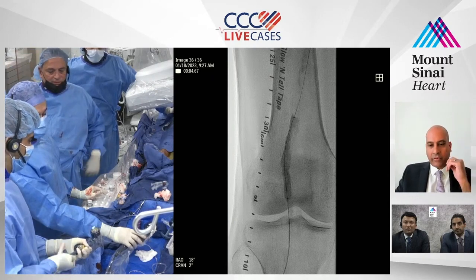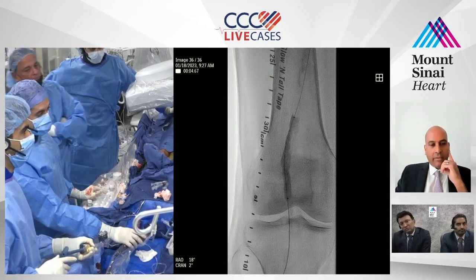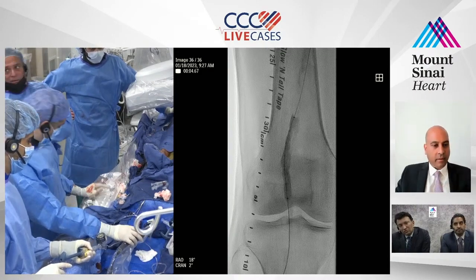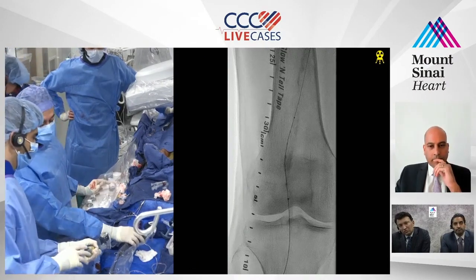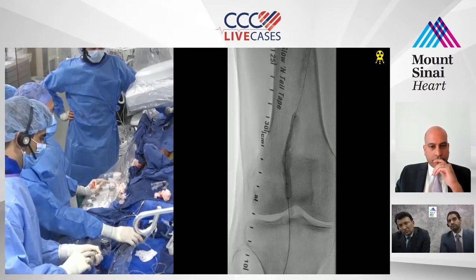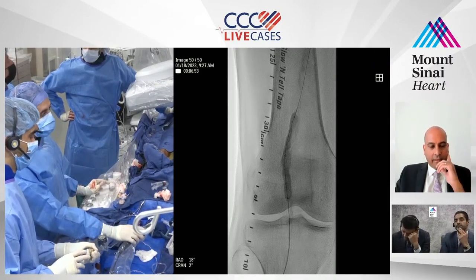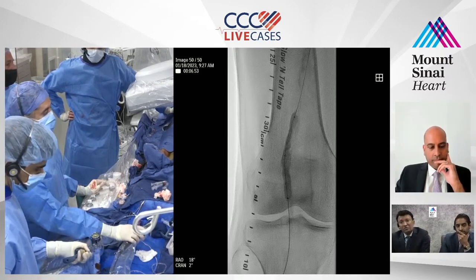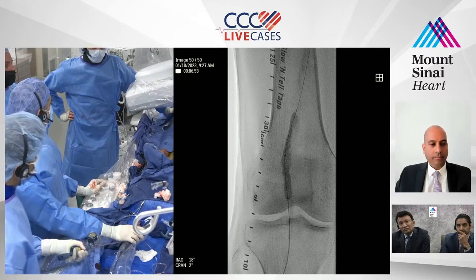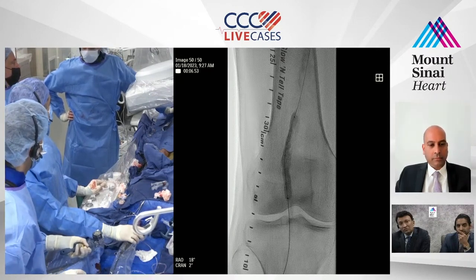Some people have done laser here. I know Jay Matthews talks about lasering even when he's in the subintimal plane. I've never done that. I don't know, Srini. I don't think laser works in my hands. I don't know, Ajit, what your thoughts are. Does laser work on calcium for you guys? No, that's what I'm saying. Definitely not. I have never had success with laser and calcium. I've only used it a few times, to be honest, but it hasn't really helped.